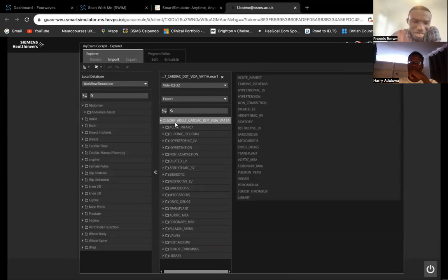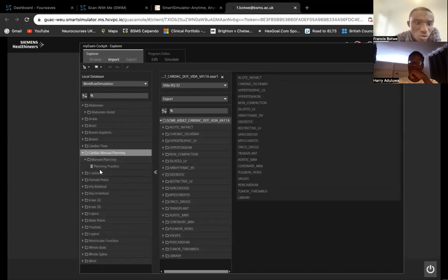And this is a whole folder, with a lot of sequences, like the same sequences here, but we are not happy with the ones, sorry. You are not happy with the ones here in the cardiac folder, and you want to import your own sequence. That is what it means. So I want to import all of these ones into the system. So I'll go to import.